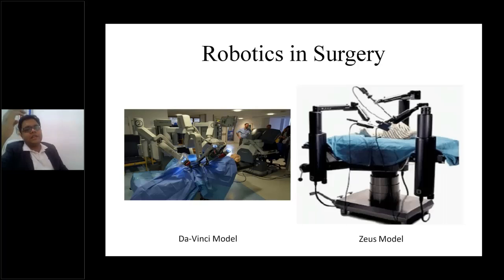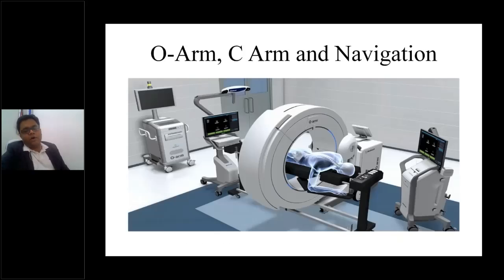However, these things are being validated. Any problem in such instruments needs to be reported ASAP. You might be a perfect robotic surgeon, but any problems with the instrument have to be reported as soon as possible.